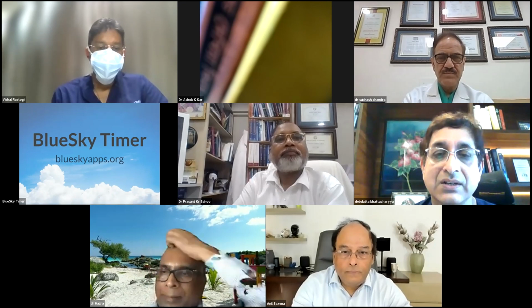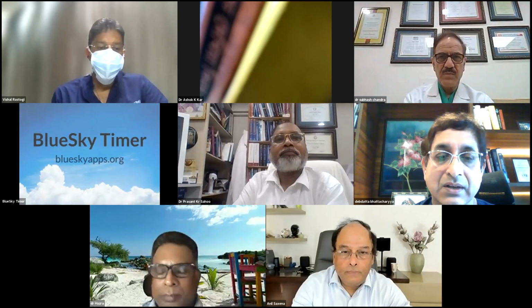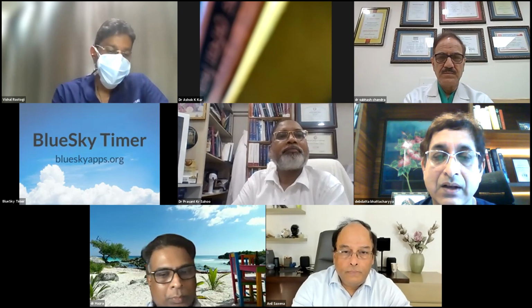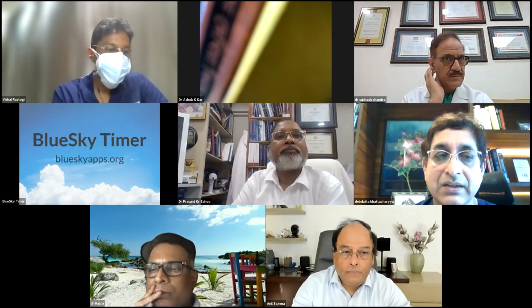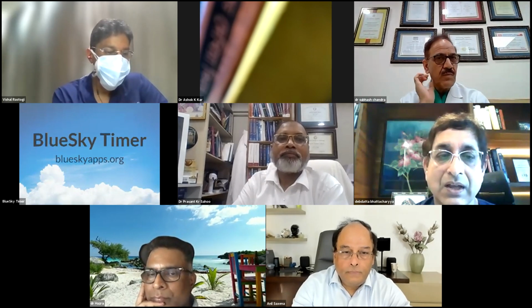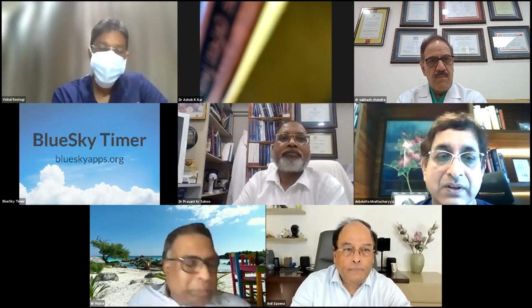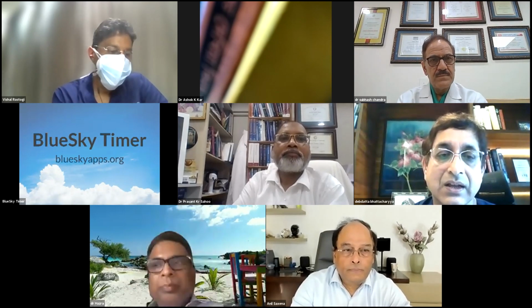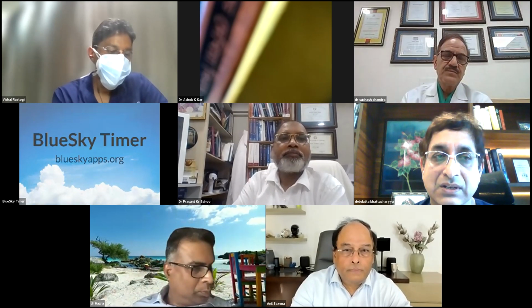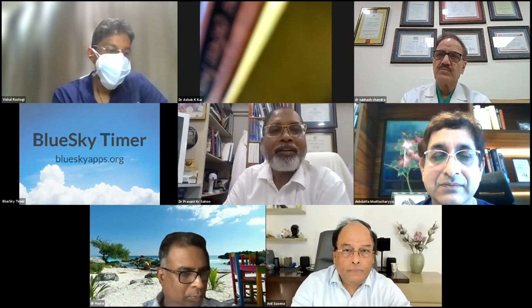In calcified lesions, as he showed in the images, the thickness of the calcium is much better appreciated by OCT, which IVUS doesn't do. However, HD IVUS has changed our view of these lesions somewhat, and we are seeing more detail in the near field that we didn't see earlier. And Dr. Sahu showed us an excellent series of cases and compared them with OCT. Maybe Dr. Sahu, you can tell us about your experience.